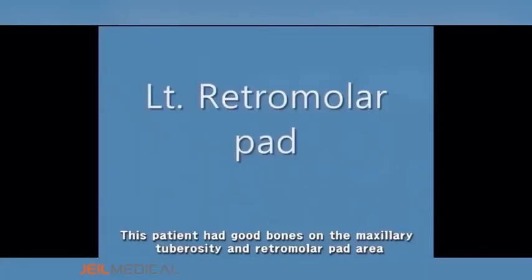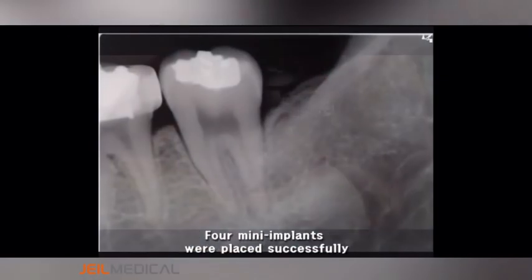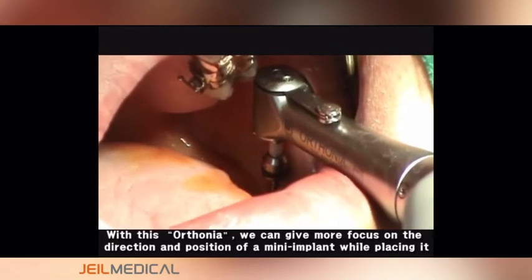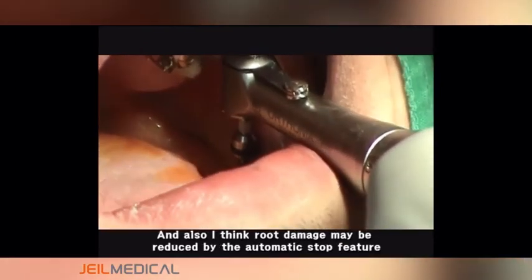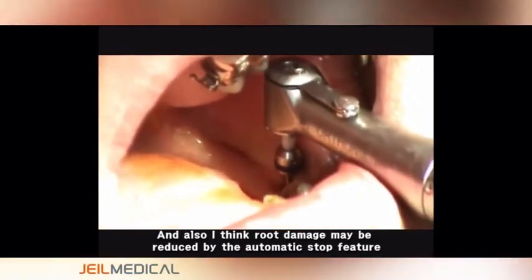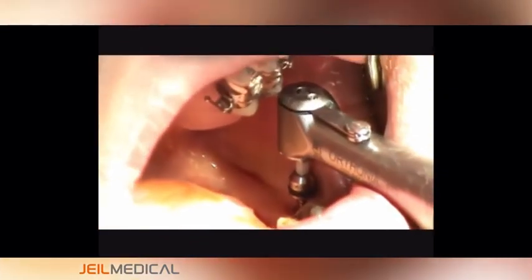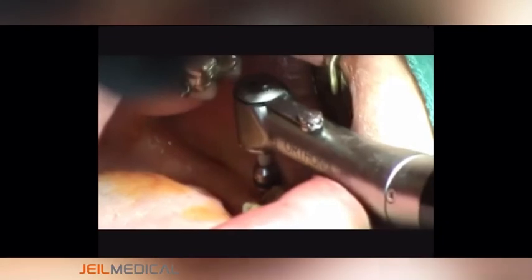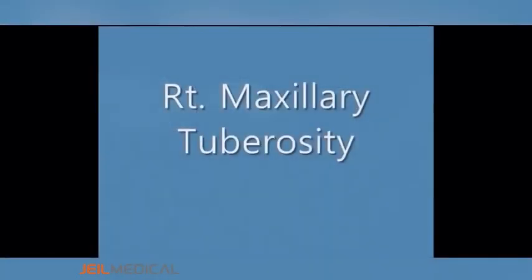This patient had good bones on the maxillary tuberosity and retromolar pad area. With this Orthonia, we can give more focus on the direction and position of a mini implant while placing it. I also think root damage may be reduced by the automatic stop feature.